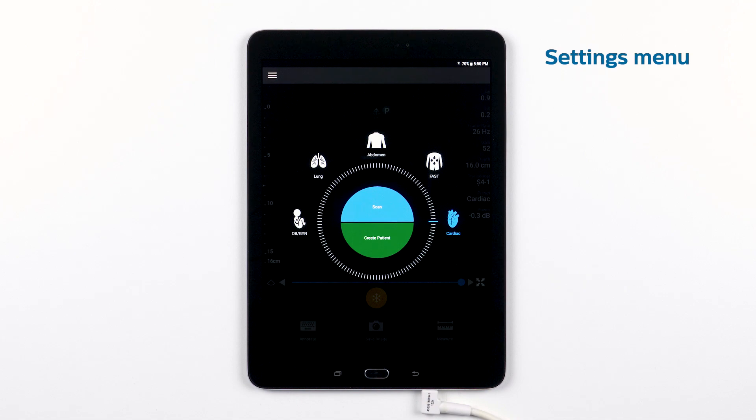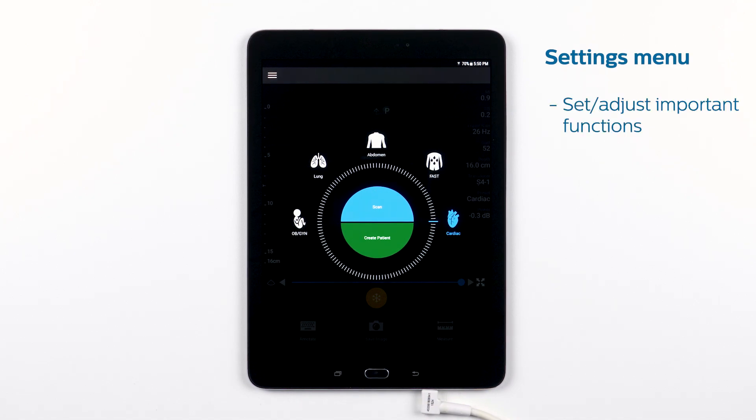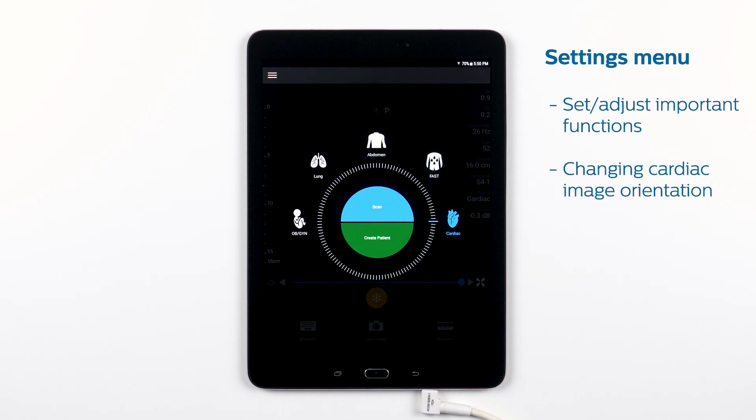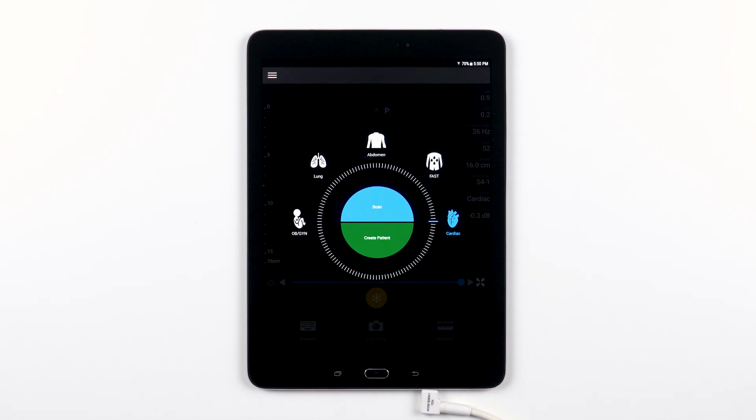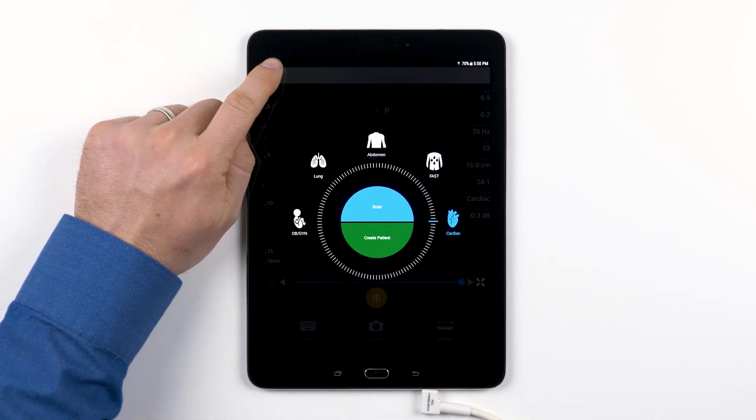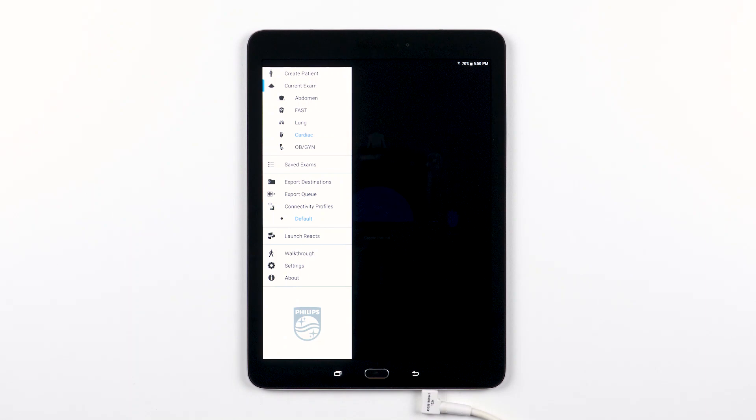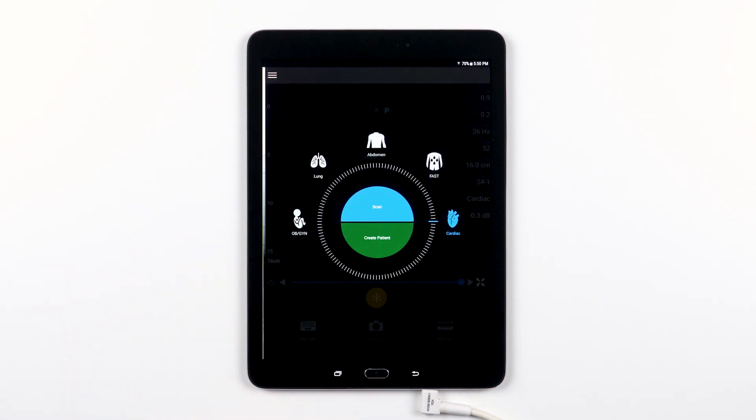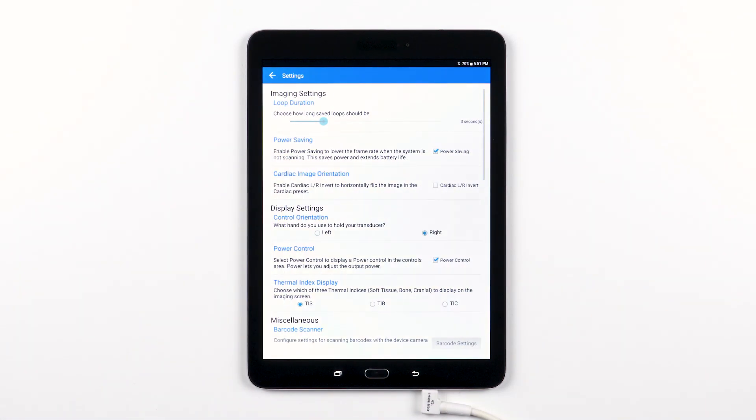In this video we'll go over the Philips Lumify settings menu where you will learn how to set and adjust important functions like the loop duration and changing the cardiac image orientation. To access the Lumify app settings, open the menu and tap settings at the bottom. We're going to go through this from top to bottom.